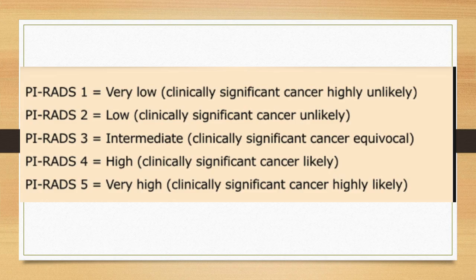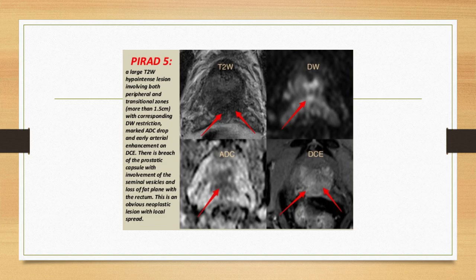These are just some images from a prostate MRI. They're kind of grainy images, but they actually have a lot of information. So just to orient you, this is the prostate gland. These are the seminal vesicles here. These are different sequences that we did, same prostate gland, but just different sequences. So this area here, can you see how this area is a little darker? Then this is a normal gland, this area is darker.